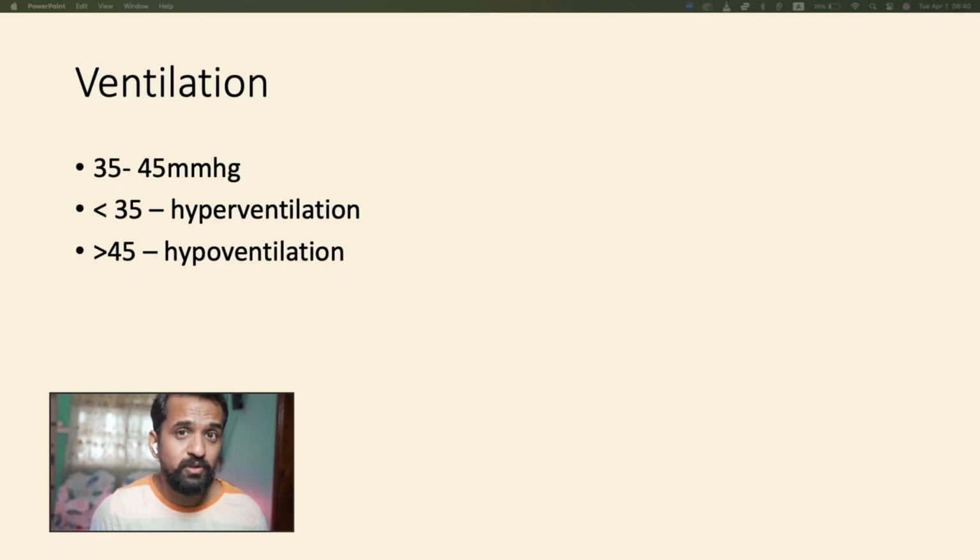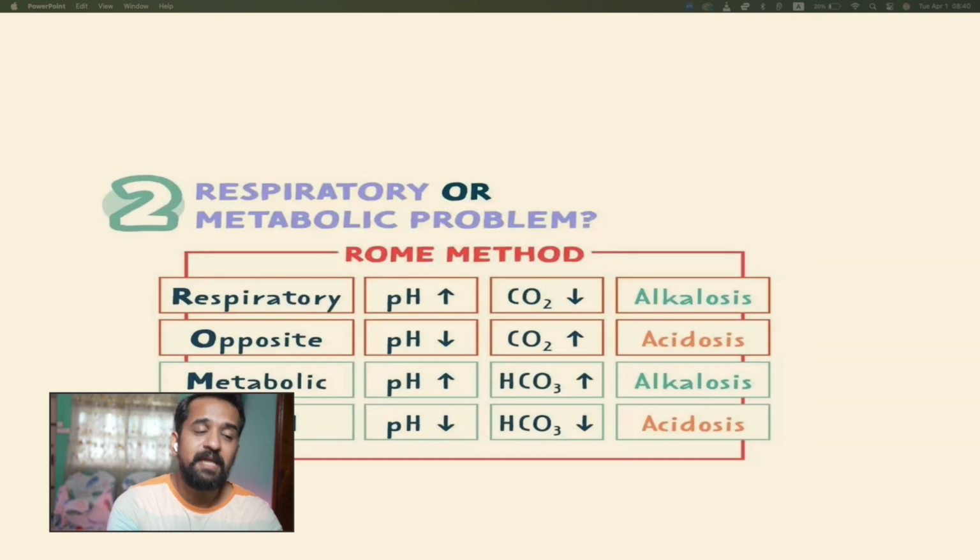For example, if you want to know whether you need to give BiPAP or not, their CO2 will be rising and you will immediately know that this patient needs BiPAP, either at night if it's a chronic patient or even at that particular moment if it's an acute case. Okay? Now the first step in any interpretation of ABG is to understand how it works.